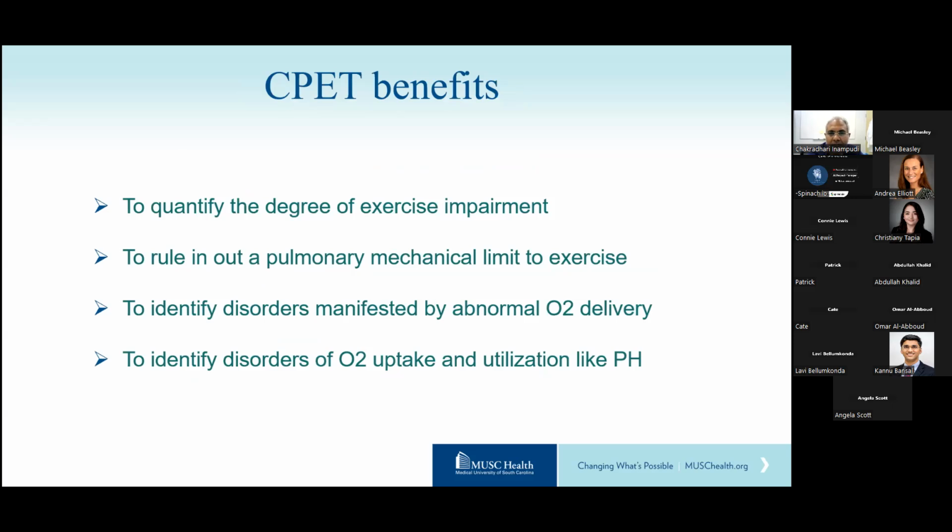The benefits, as I mentioned before, are to quantify the degree of exercise impairment. We can also rule in or out a pulmonary mechanical limitation to exercise. We can identify disorders that are manifested by an abnormal O2 delivery, or identify disorders of oxygen uptake and utilization, like pulmonary hypertension.